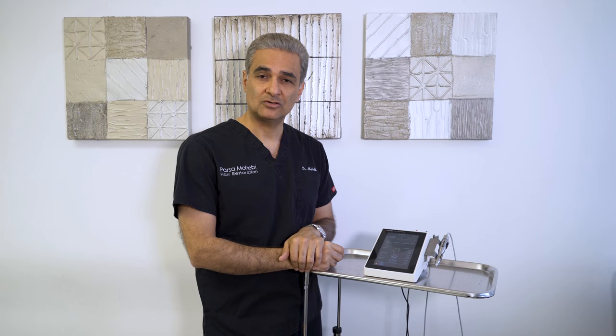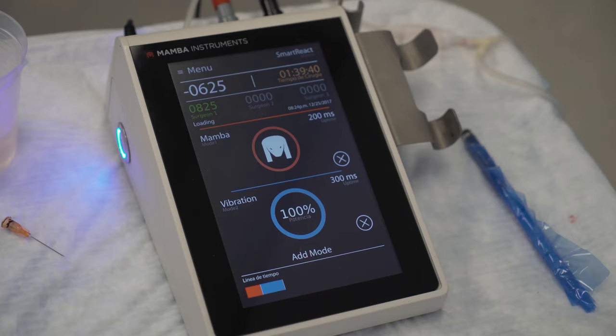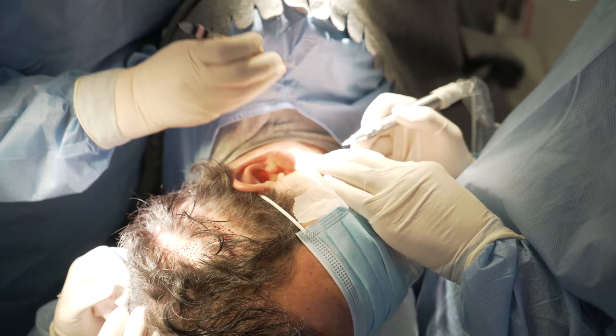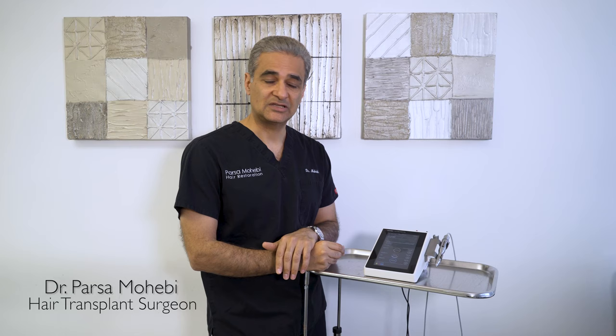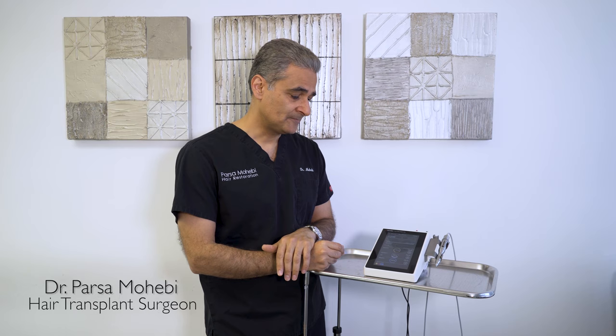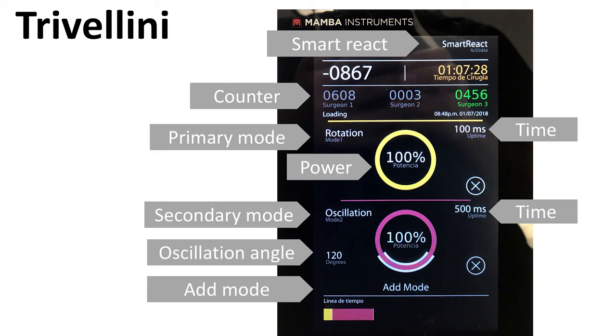The Trevelini machine, or Mamba, is a great device which is polyphasic and gives you the chance to go into different layers of the skin with multiple modes. It can also give you pedal-free operation with a smart react function, and you can monitor everything — the speed of the procedure, the amount of time, and the number of extraction attempts.